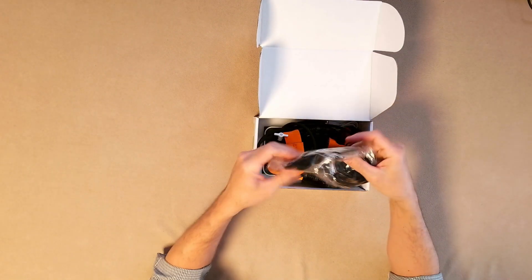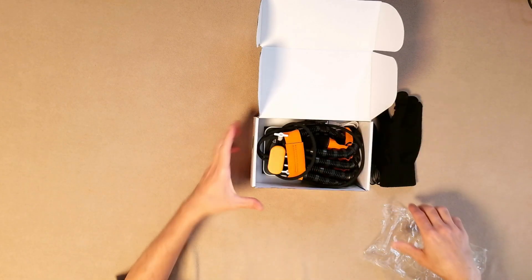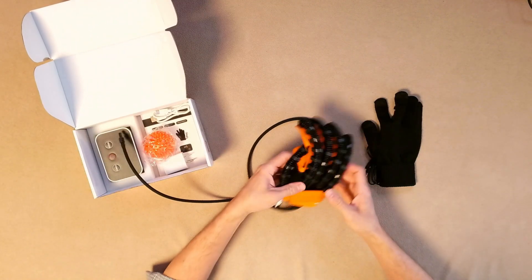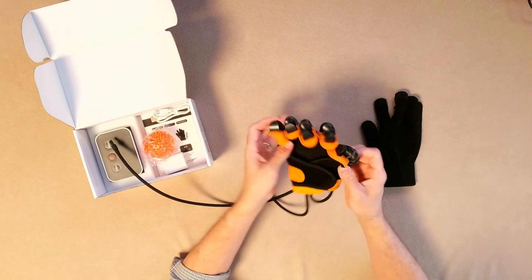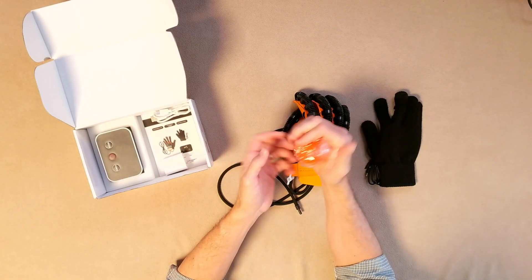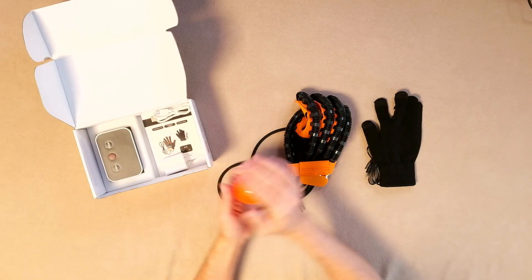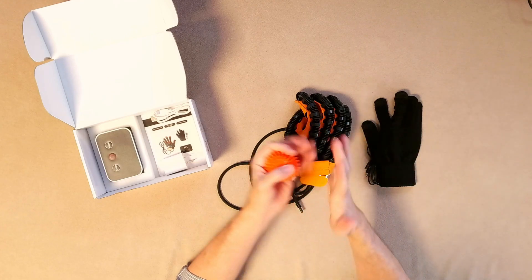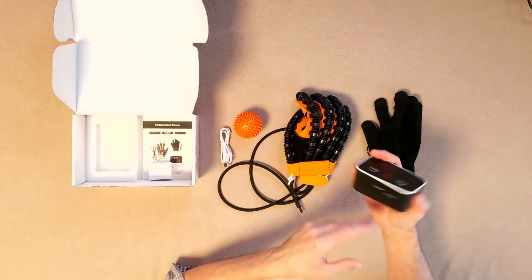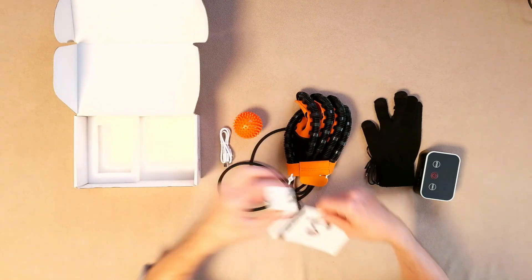Alright, here we go. Got this little glove here. Oh, that looks super futuristic — check that thing out, that looks pretty cool. Looks like a little training ball too for grabbing. The training part is getting it out of there. Roll your hand on that for some stimulation. Got a little USB thing, a plug-in little device. And let's get some instructions here as well.